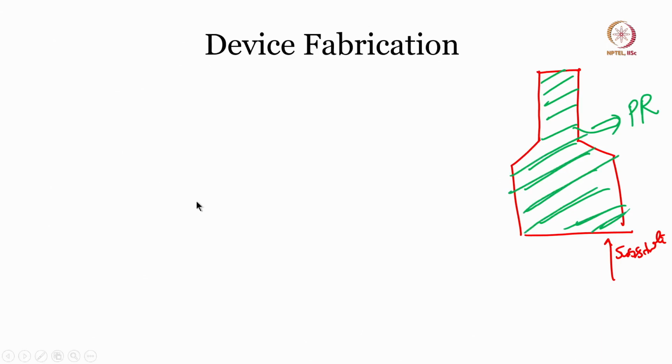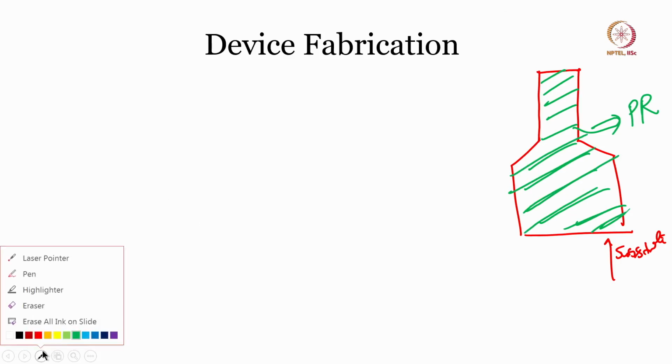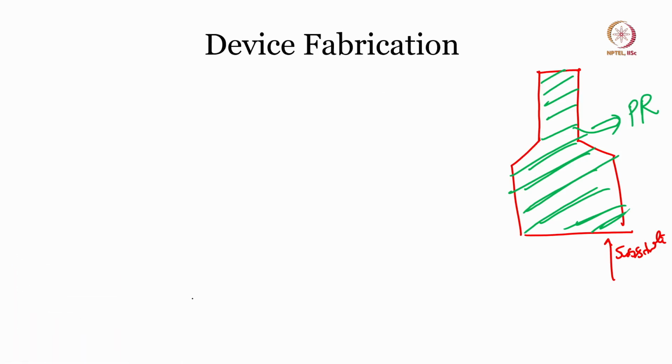For example, if you have not understood, that will be covered later. Anyways, no problem. So, there is a photoresist that is deposited. Now, you want to etch the photoresist from some areas. In some areas wherever you do not need photoresist, means you want the gold to be there. So, this is the area. Wherever I am showing, understand that photoresist has been removed.